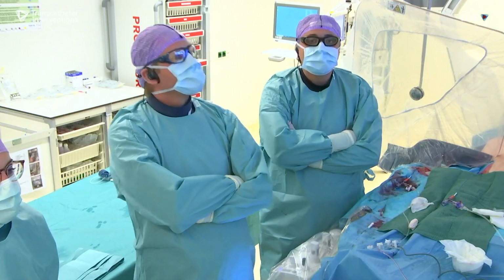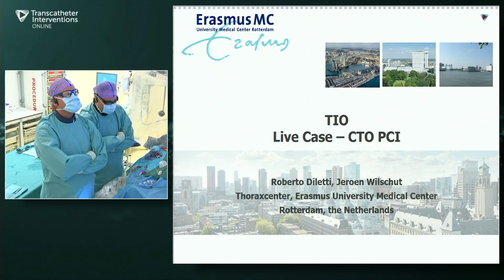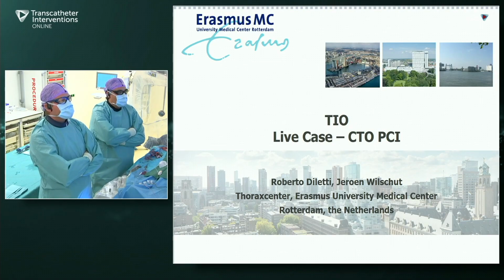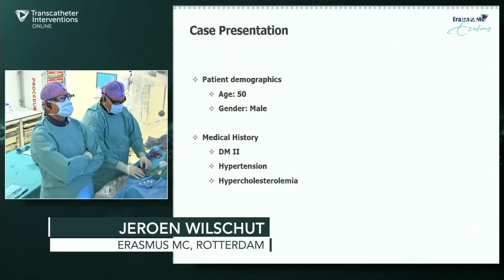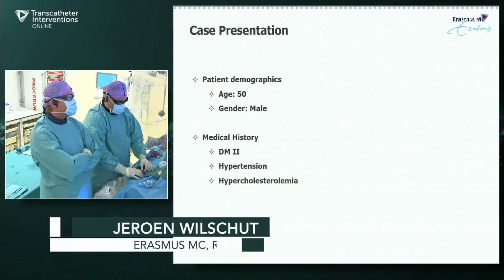Thanks for the introduction, Roberto. There we see our slides. So maybe we can take a look at the patient demographics. I think we've got an interesting case today of a CTO.